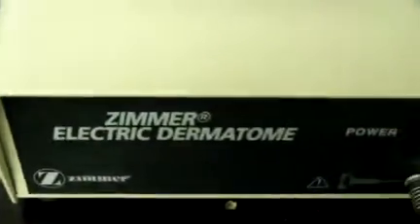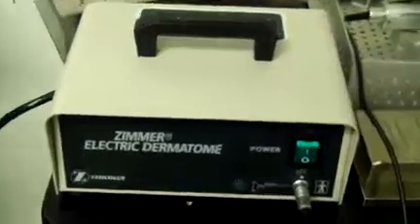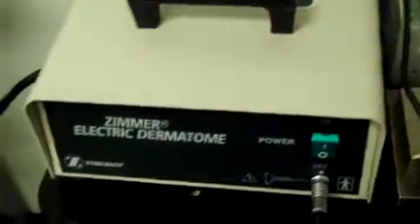Today we're looking at the Zimmer Electric Dermatome. With this I have the power unit, the console, and the driver.